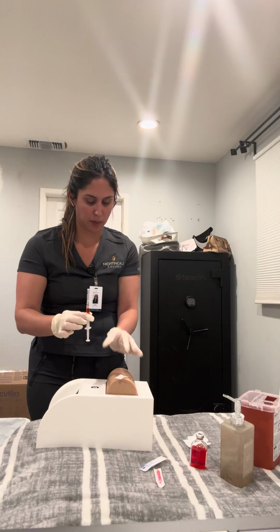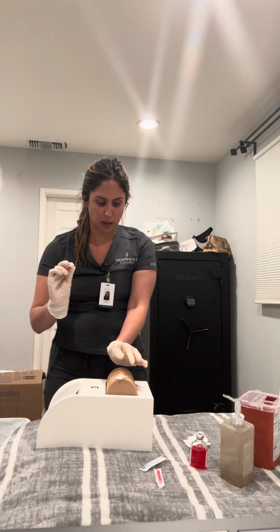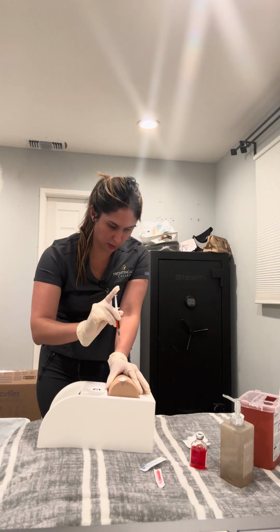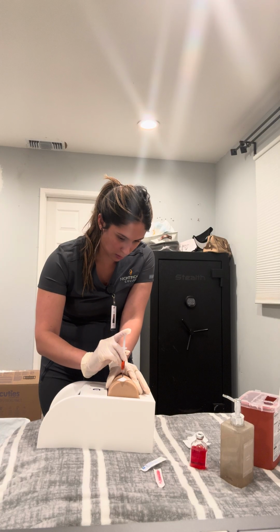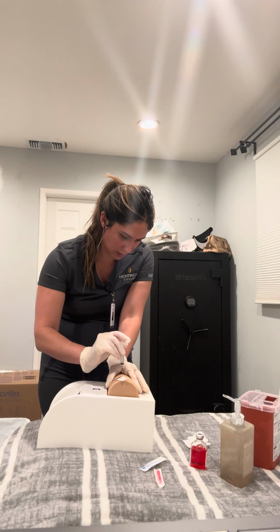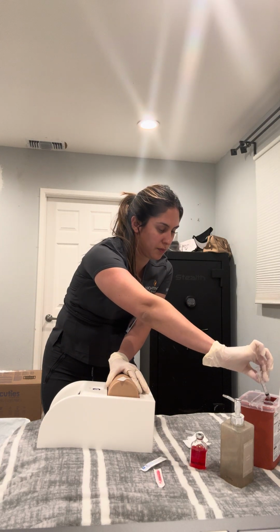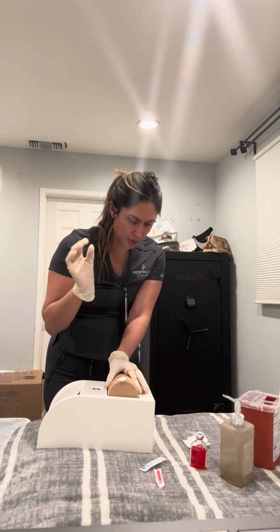I'm going to uncap, grab like this and get the patient where I'm comfortable. I'm going to go at a 90-degree angle and push down. I'm going to inject 10 seconds per ml. Once I'm done, I'll slowly come out. Now I'm going to put this in the sharps container.